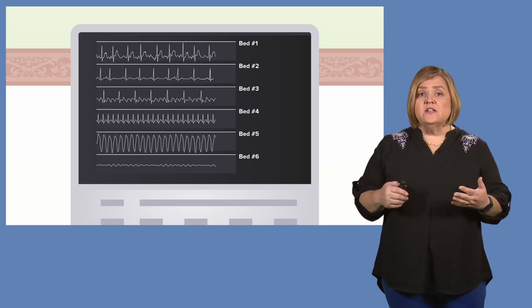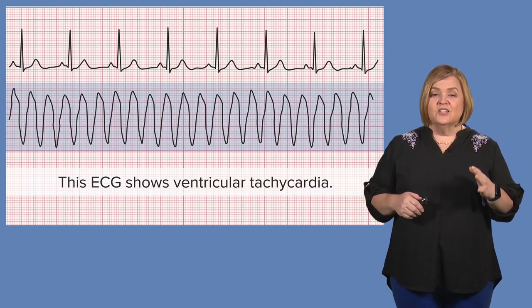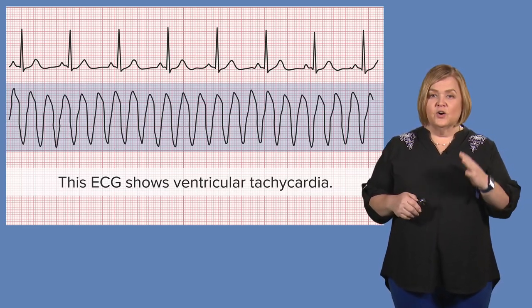This time, we need to check on this man. After our previous discussions, at first glance, we definitely know something is wrong with this ECG. But what exactly is it? Let's take a closer look. Whoa, this ECG is ventricular tachycardia.